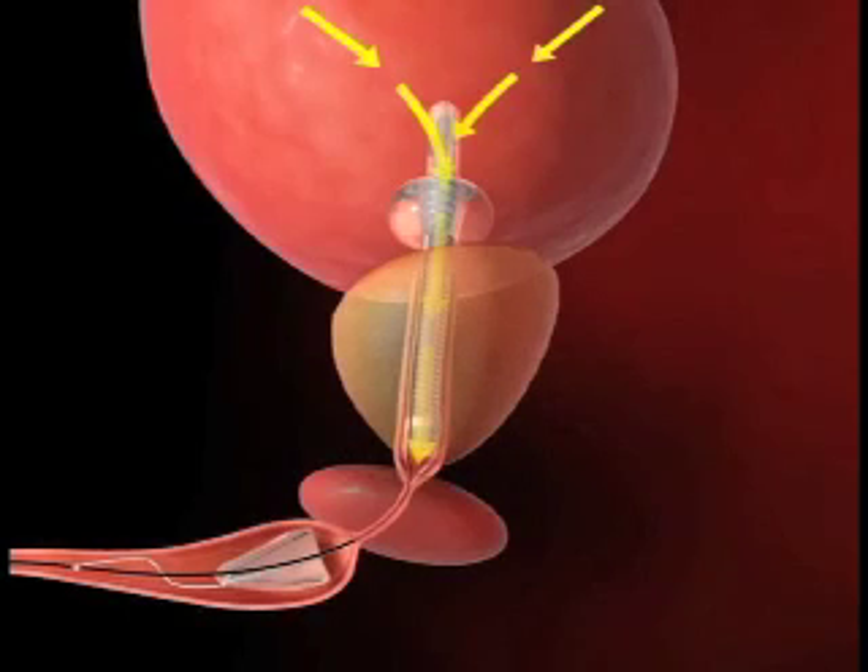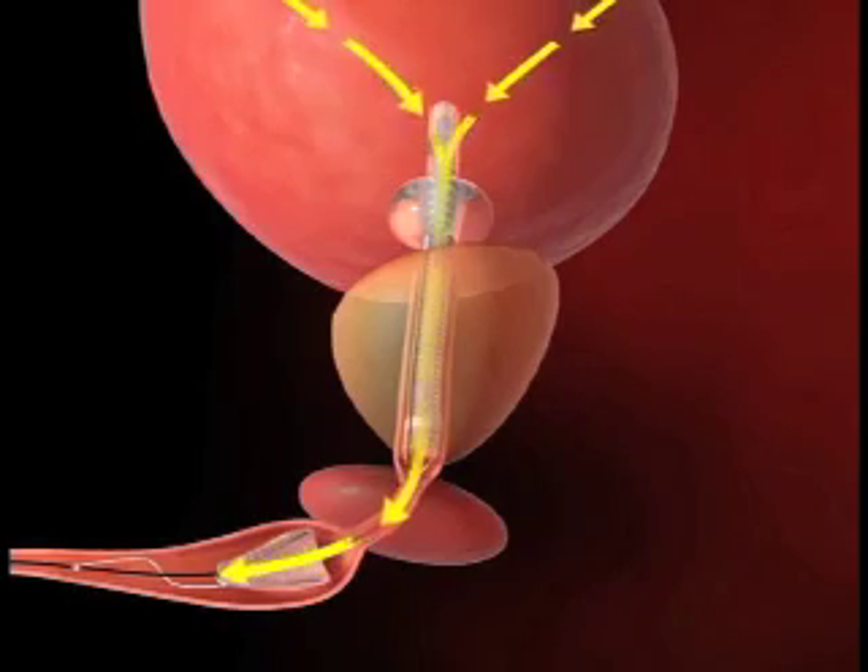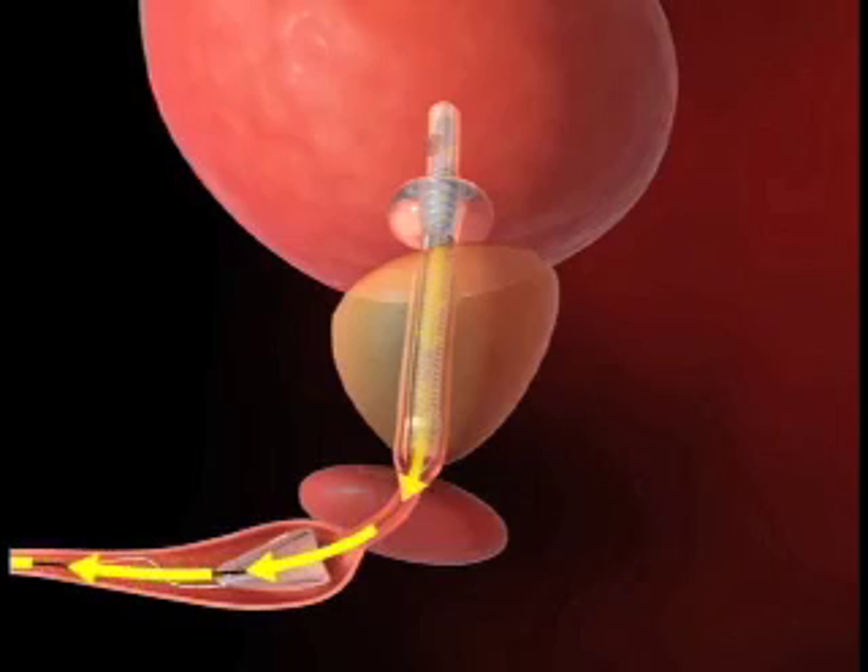The Spanner is designed to provide a patent lumen through the prostate to allow for the passage of urine. The Spanner allows for the external sphincter to continue functioning while in place. With the prosthetic urethra stented open and the external sphincter controlling the release of urine, patients are able to void normally and remain dry with the Spanner.